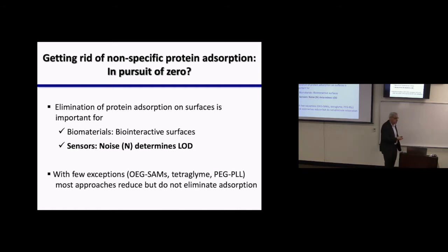And there's a threshold, an asymptote of the kind of sensitivity, low limits of detection you can get by amplification methods, especially when you're doing it on a surface. And what I'll show you is the reverse.